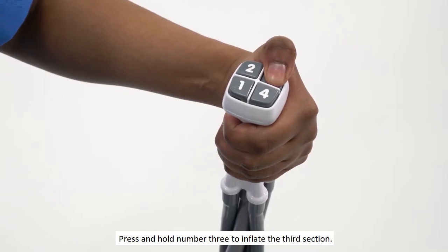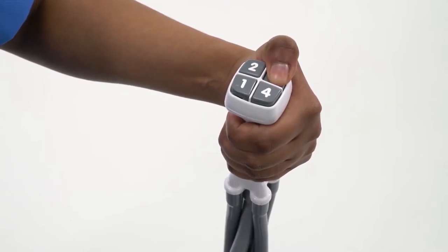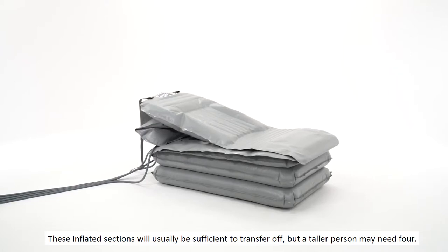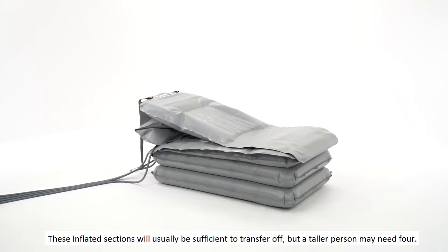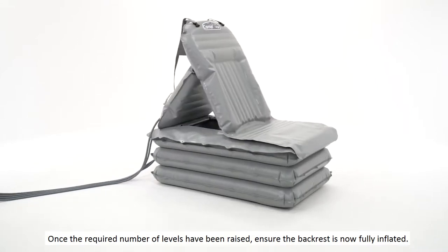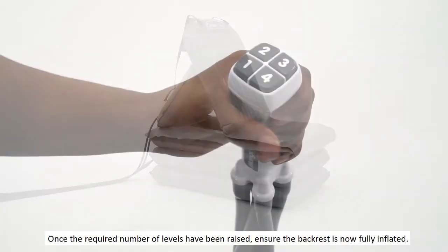Press and hold number three to inflate the third section. These inflated sections will usually be sufficient to transfer off, but a taller person may need four. Once the required number of levels have been raised, ensure the backrest is now fully inflated.